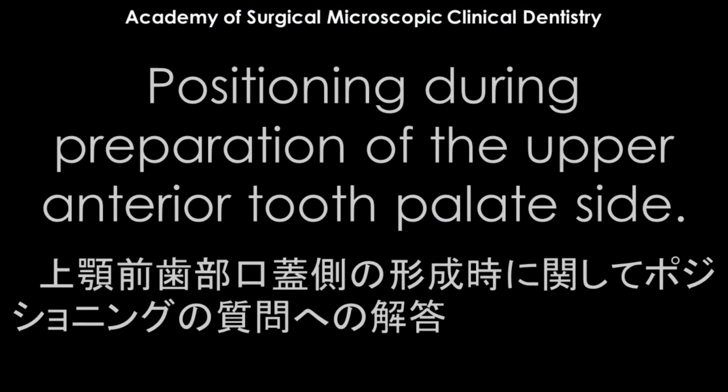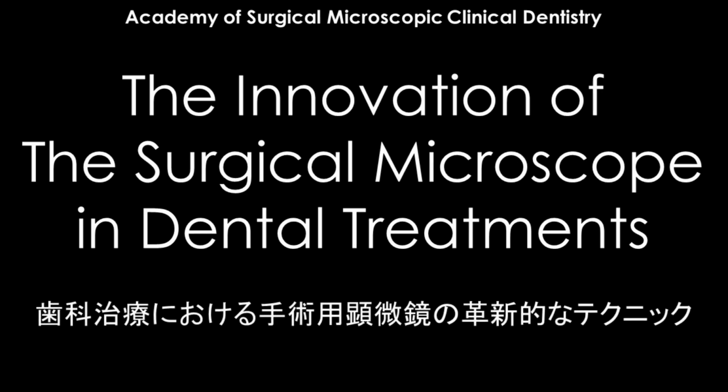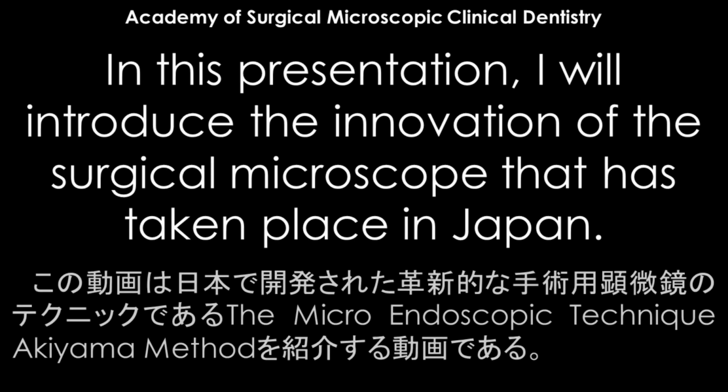Positioning during preparation of the upper anterior teeth palate side. The innovation of the surgical microscope in dental treatments. In this presentation, I will introduce the innovation of the surgical microscope that has taken place in Japan.